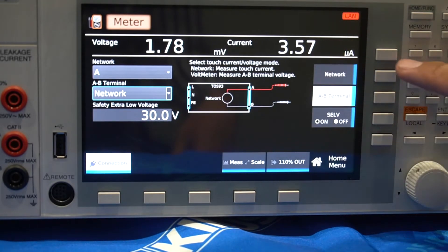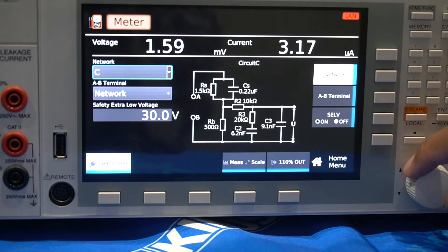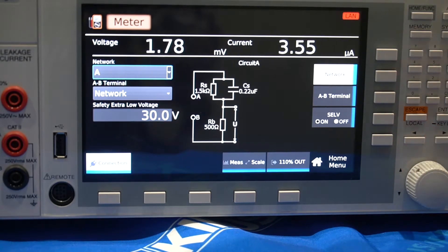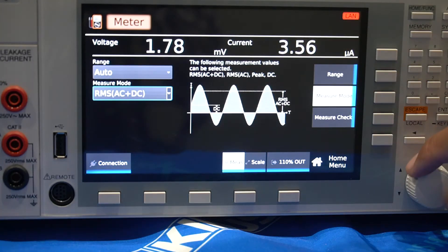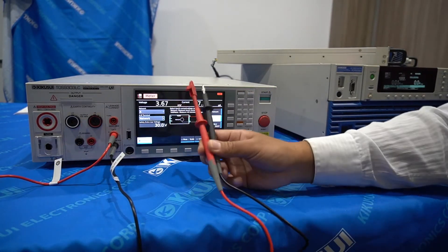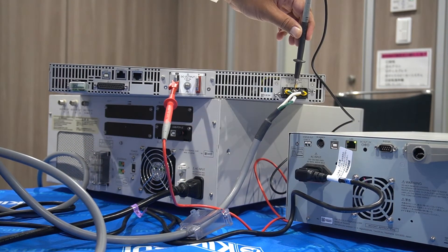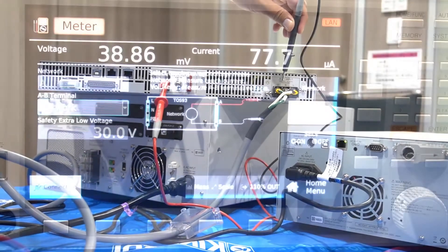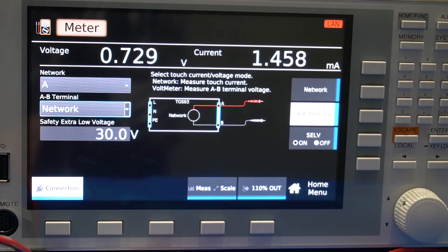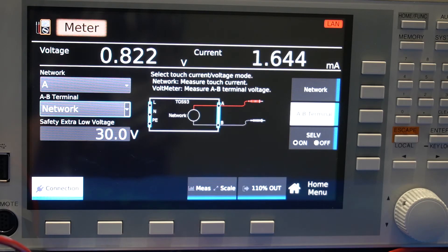For this test, the EUT has changed to a much higher capacity device and we are now required to use two probes. Make sure the connections are secure. The red terminal connects to the metal chassis of the EUT. The black terminal connects to the input of the EUT. Change the measurement points to the L, N and GROUND.